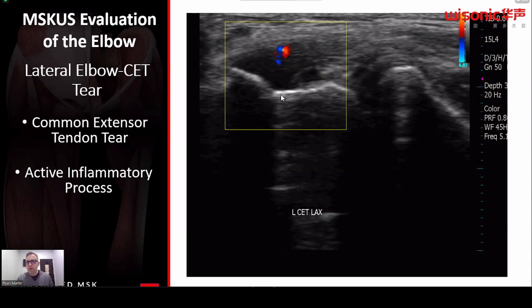Now, I don't know if other presenters have explained this or not, but using Doppler is not just for vascularity. Doppler, by nature, from a physics point of view, only cares about motion, right? And you can use power versus color to determine direction of flow.